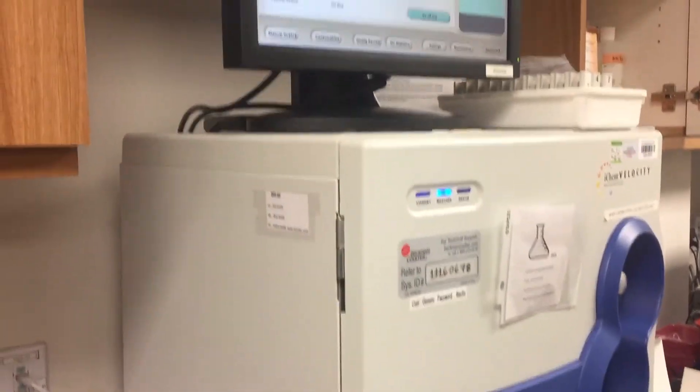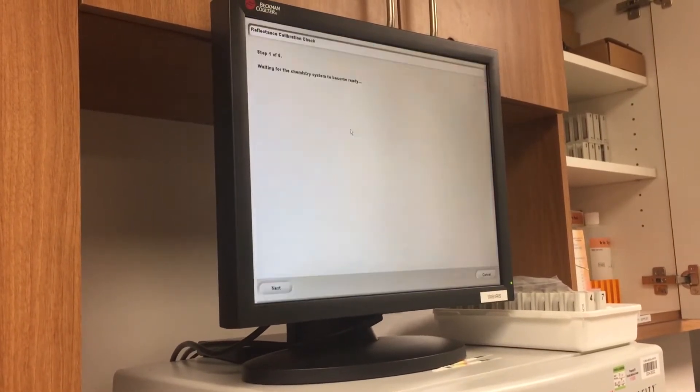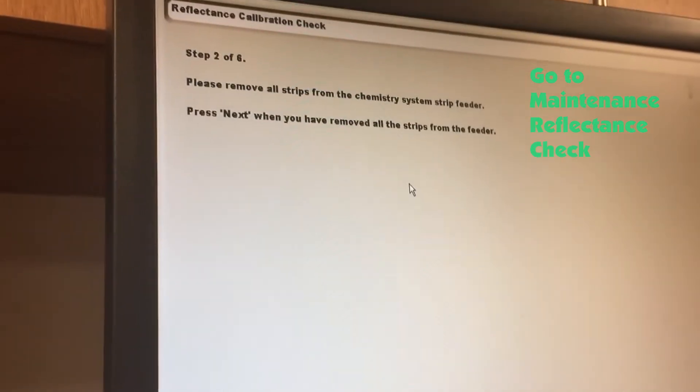You're going to go to Maintenance, then Reflectance Check, and we're going to follow the prompt. You're going to click Next.